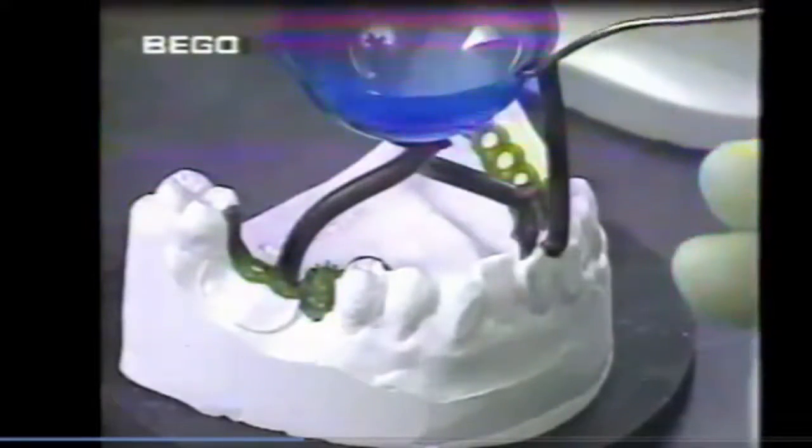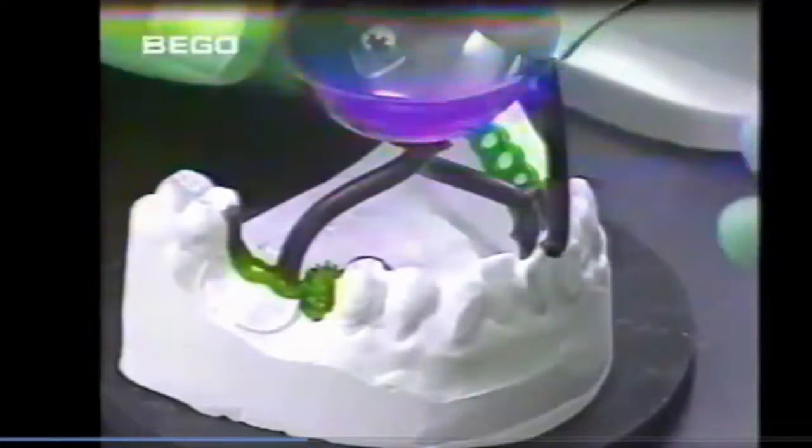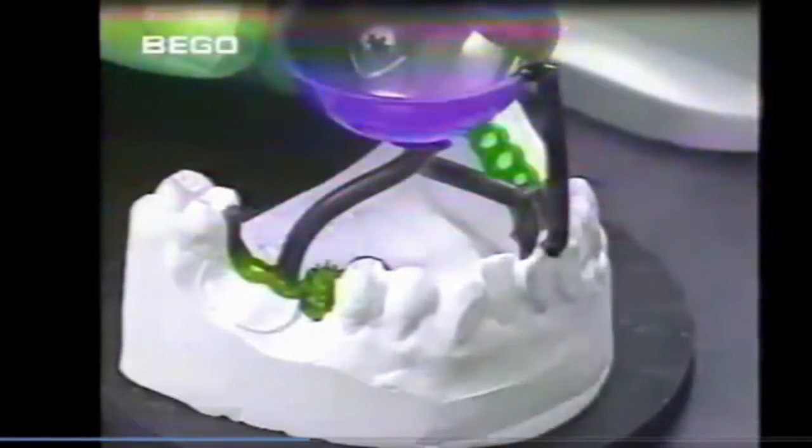On this work as well, the sprues are kept as short as possible, but follow a slight curve to the casting object. All of the fixing points are waxed right around, without any gaps. This prevents any investment material particles being entrained with the melt as it flows in. With 2 sprues, the funnel former should be provided with additional stabilization.